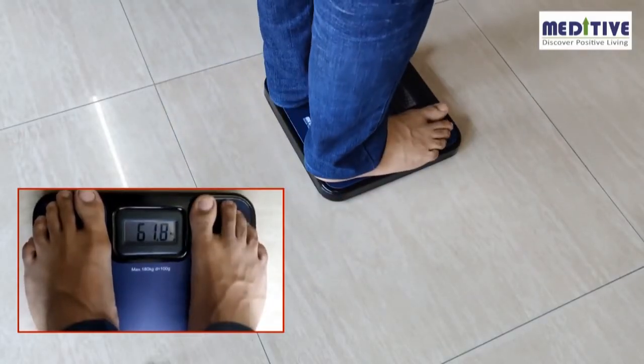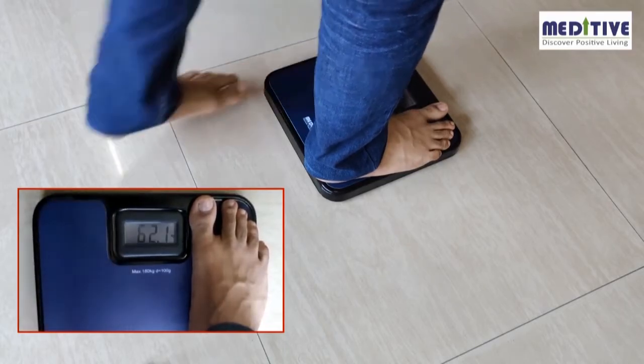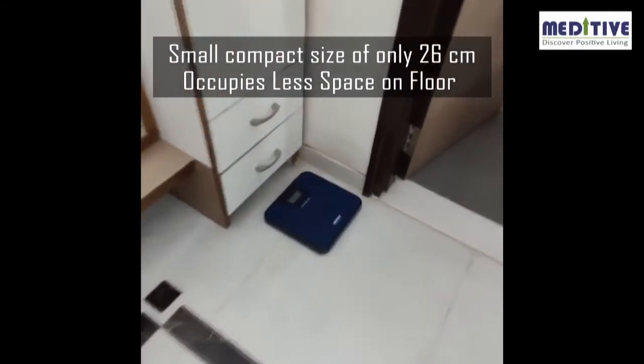You can then take the measurement a third time — the reading will remain the same. The reading stays on the display for about five seconds, so you can step down and still see the reading on the scale. The scale also has an auto-off feature to save power.